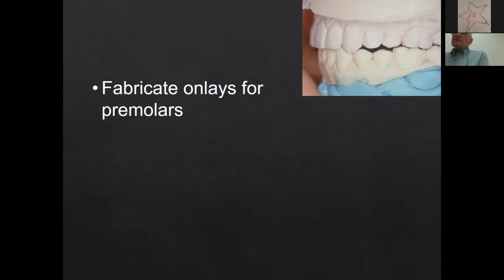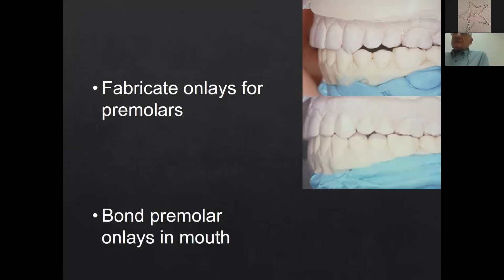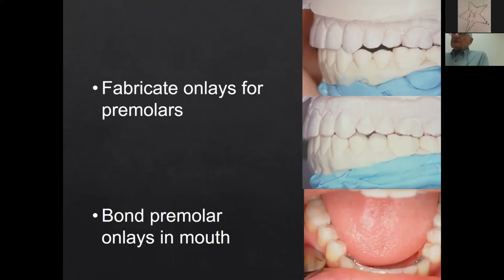So now we have the space created to do the ceramic onlays on the premolars, the indirect. So we fabricate the onlays and we bond the onlays intraorally. So now all of our posterior bite is in ceramic onlays.